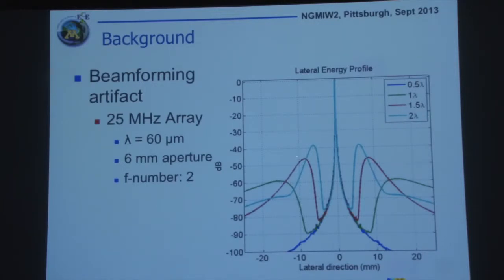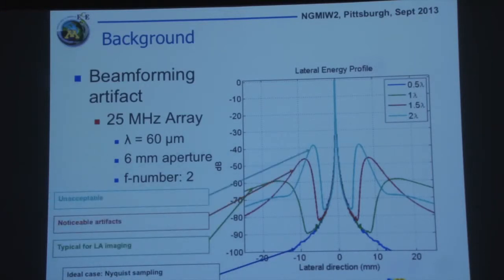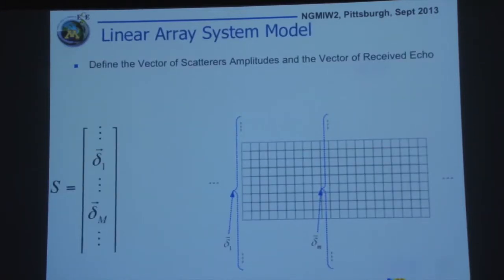So for example, at 2 lambda, even without steering, just by F2 focusing, F number of 2, you have grating lobes in the 40 dB, which is unacceptable. They become very objectionable. Indeed. So we can actually compensate for that by reconstructive techniques. And that's what I'd like to discuss next.